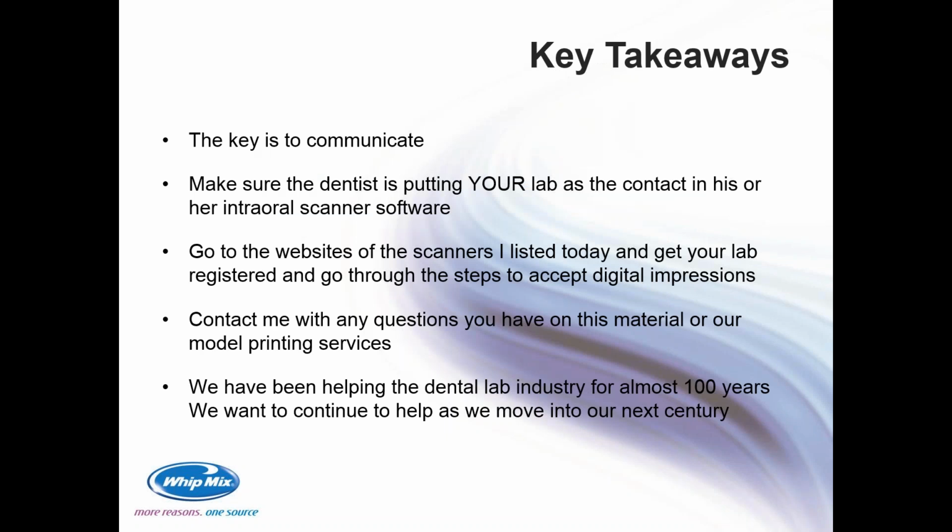So as we're wrapping up, I'll give you my key takeaways, and really I feel the key is to communicate. There's many different reasons for this. Make sure that your dentist is putting your lab as the contact in his or her intraoral scanner.